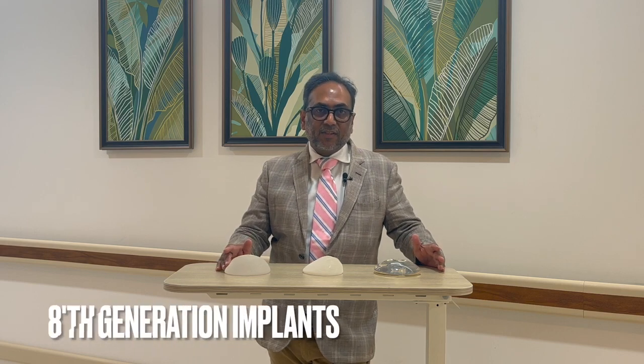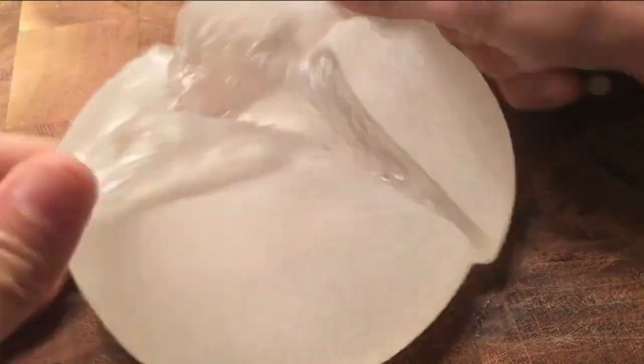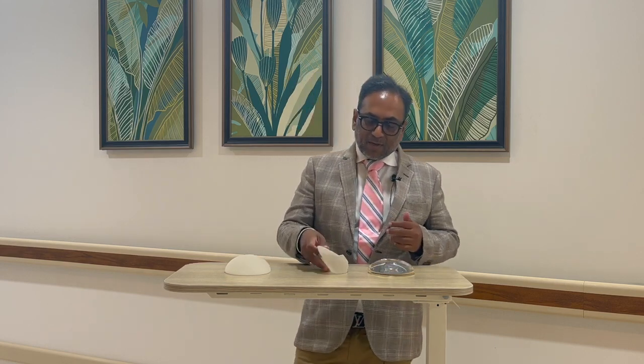What we have at the moment is the 8th generation of implants, which means that all these implants are filled with a cohesive gel, which means that when you actually cut an implant, the gel doesn't leak or bleed. It remains like a solid block, and it remains in the body. Unlike the earlier generation implants, there were a lot of silicone leaks, and there used to be a lot of bleeds, which created a lot of problems for the patient. But the present generation of implants are very advanced, and have a cohesive gel of silicone within them.